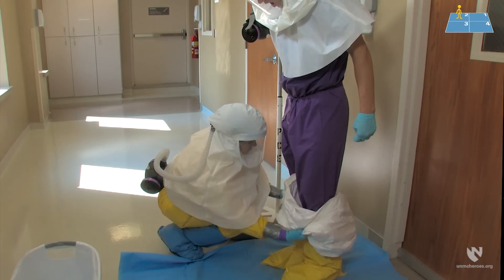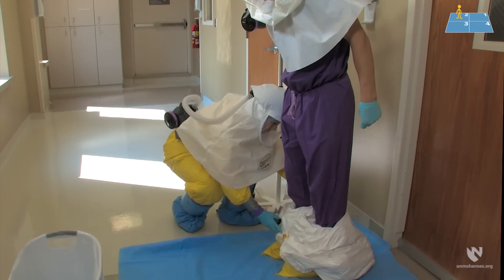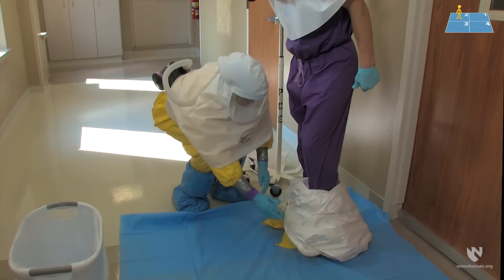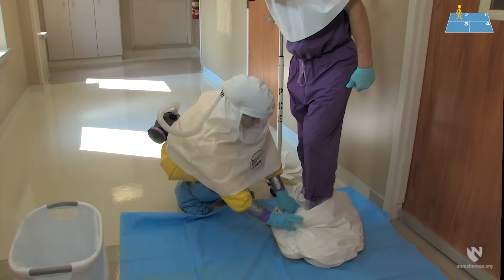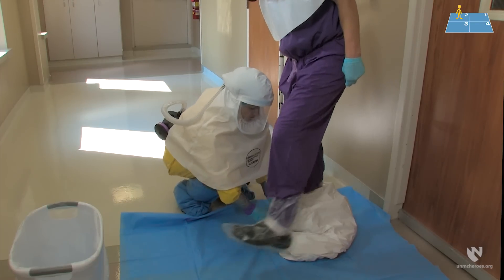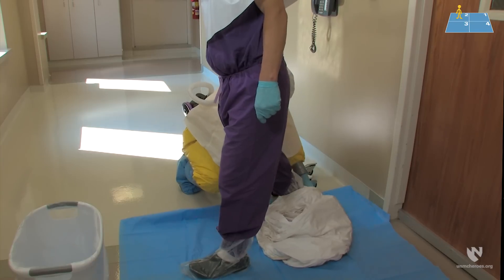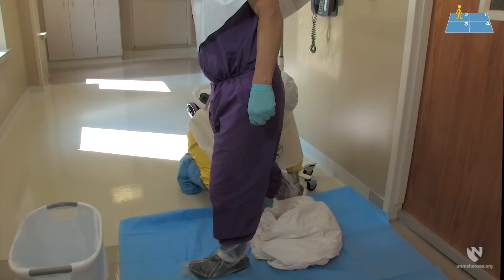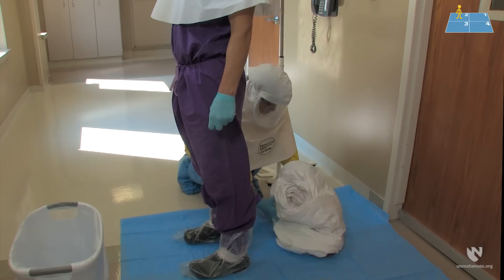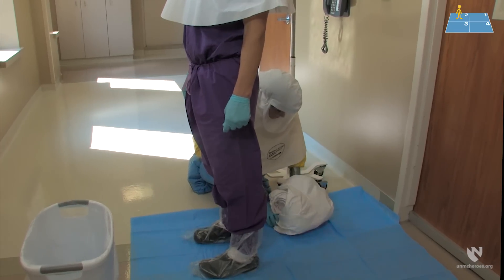Carry on rolling the suit downwards until the ankles are reached. When the suit has been rolled all the way down, carefully step out and onto the clean half of the doffing pad into quarter number three. Remember that you are still connected to the IV pole by the PAPR tubing. The doffing partner will carefully gather up the suit and place it gently in the trash.